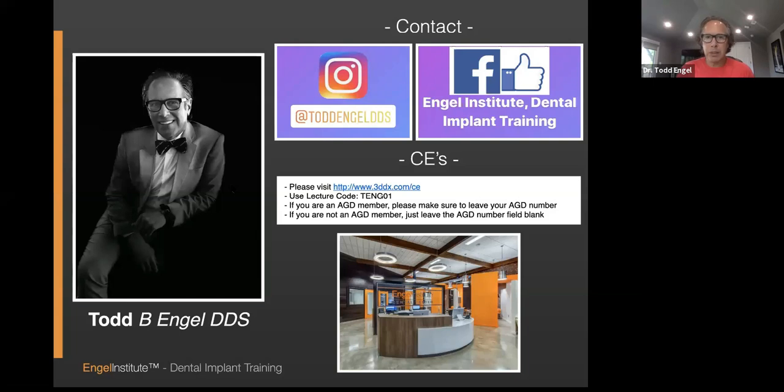So check with your CBCT manufacturer and see. On mine, I have an ultra low dose, so I can scan children and I can do post-op scans. So you want to make sure before you go post-scanning everybody and everything that you are FDA approved with the machine and the technology that you have to do so. If you want to Instagram me, I'm not trying to push that. I'm just saying I can answer more questions. I'll tell you how I do it and what I do. But I am FDA approved to do that. So I would recommend that if you're looking for a CBCT, that you definitely check that box, that it's FDA approved for a post-op scan and children.